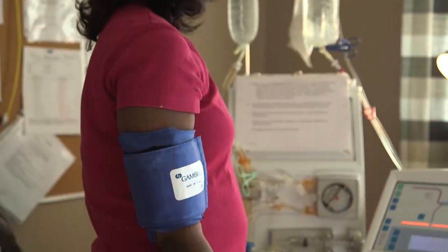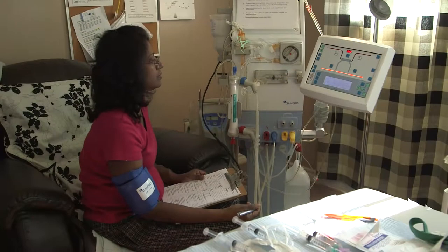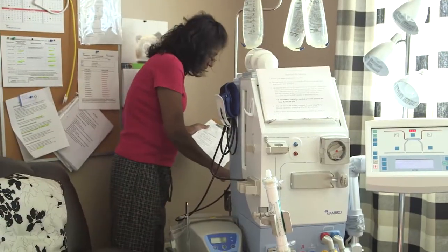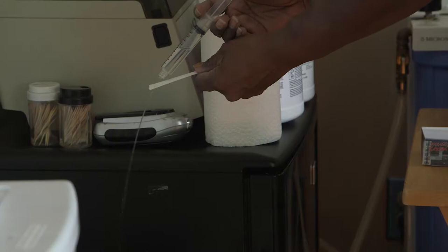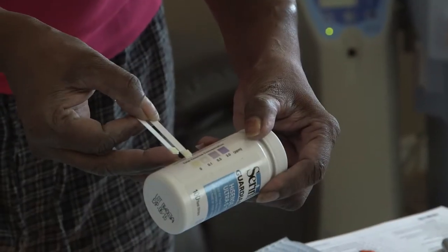Information such as weight, pulse, blood pressure, temperature, and exchange durations represent data captured before, during, and after the exchange. Readings are also taken relating to equipment levels prior to commencing, and testing of fluid supplies to and from the machine is performed to ensure no contamination.